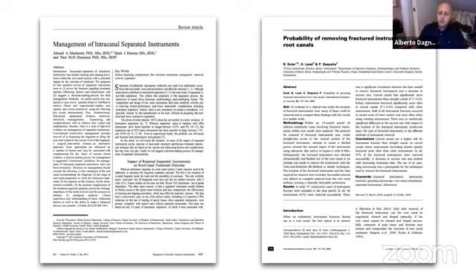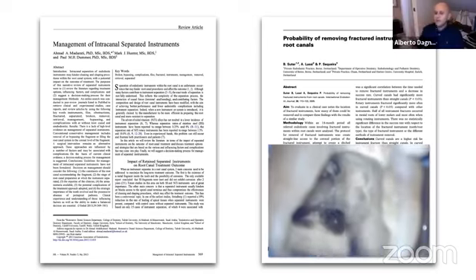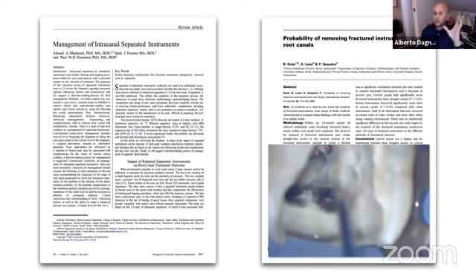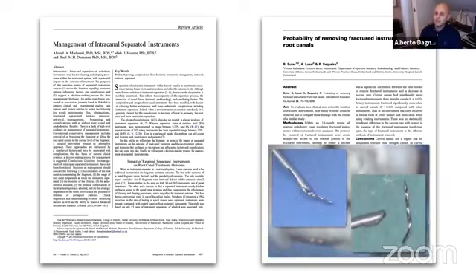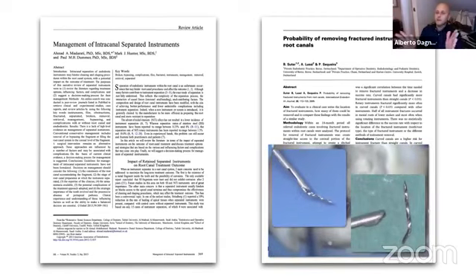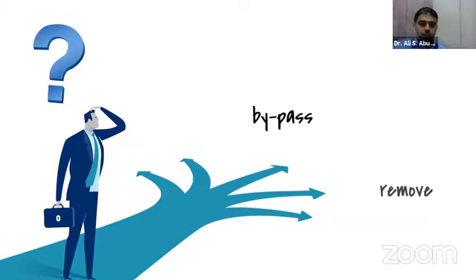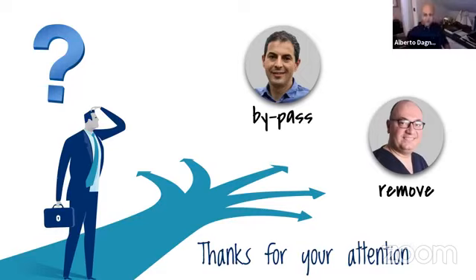So we have many colleagues, many articles in the literature showing how to manage separated files inside the root canal. But we know that the best solution probably is to remove it. But in many cases, we are not able to remove a fragment from a root canal. So we have two choices. But thank you, Dr. Alberto, for the very nice presentation. To the colleague, yes, the time to speak about two choices: bypass and removal of the files.